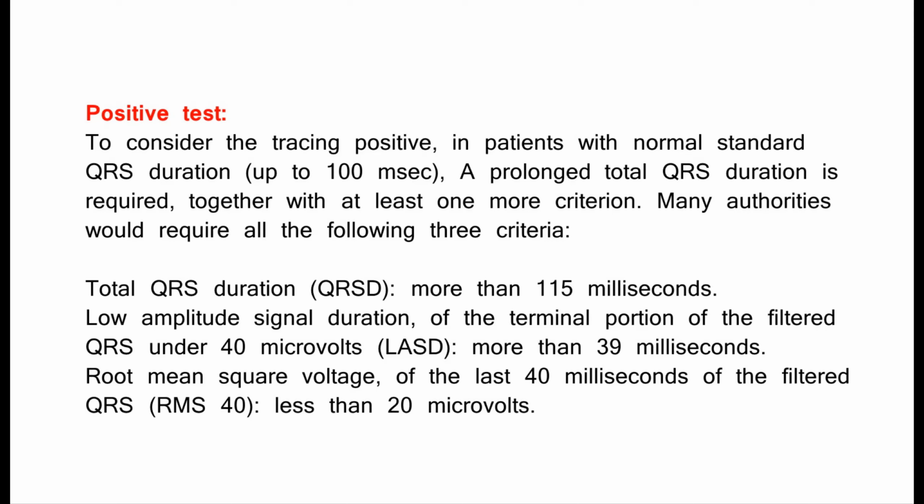Total QRS duration, QRSD, more than 115 milliseconds. Low amplitude signal duration, of the terminal portion of the filtered QRS under 40 microvolts, LASD, more than 39 milliseconds. Root mean square voltage, of the last 40 milliseconds of the filtered QRS, RMS 40, less than 20 microvolts.